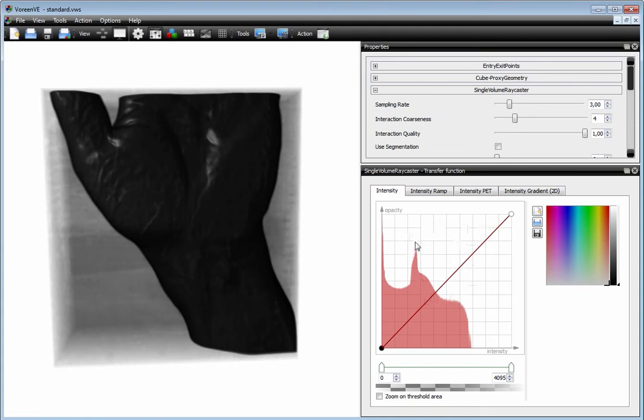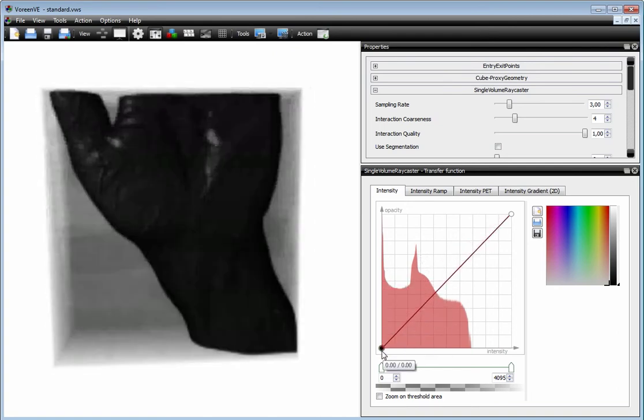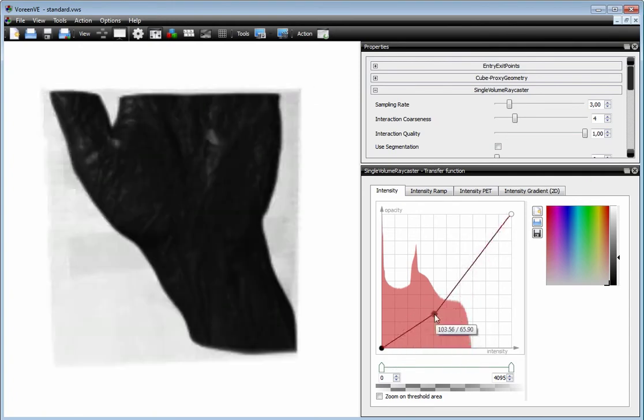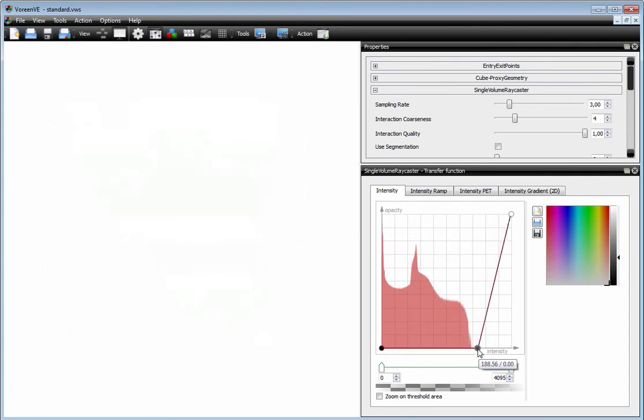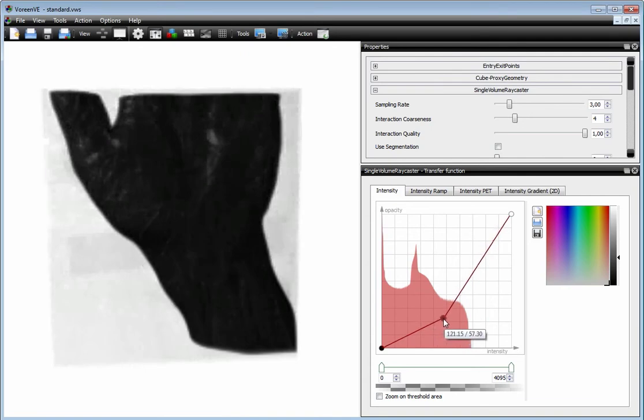Here we are in the 1D Transfer Function mode. Here you can see the histogram of the dataset and you have the keys on the area where you can also add keys and move them and immediately see the visual feedback of the Transfer Function.